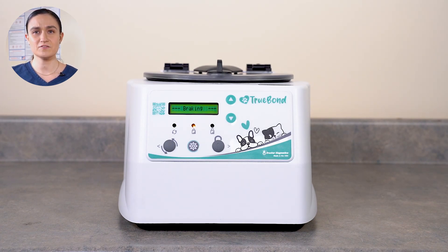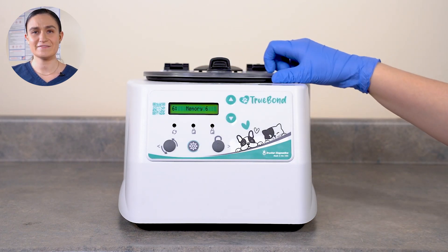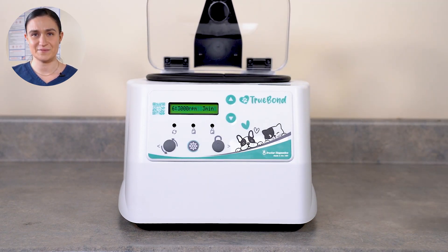Once the run is complete, the centrifuge will begin to slow down, applying the rotor brake at the level you selected. When the rotor is fully stopped, the centrifuge will beep and the lid lights will flash to let you know it's done. The centrifuge will automatically unlock. Turn the lid latch a quarter turn counterclockwise and then lift the lid to retrieve your spun samples.